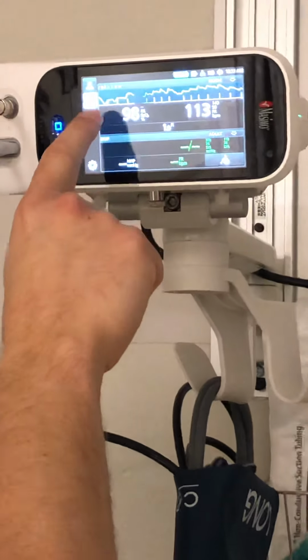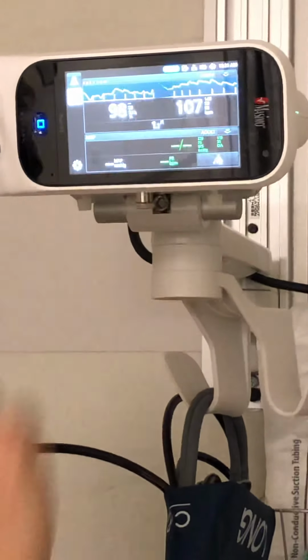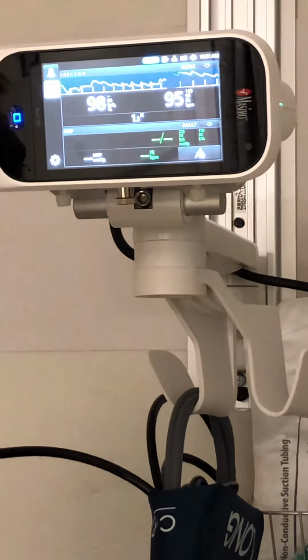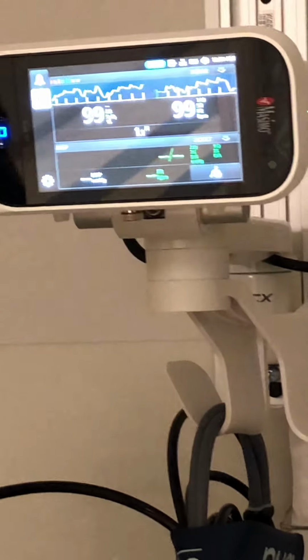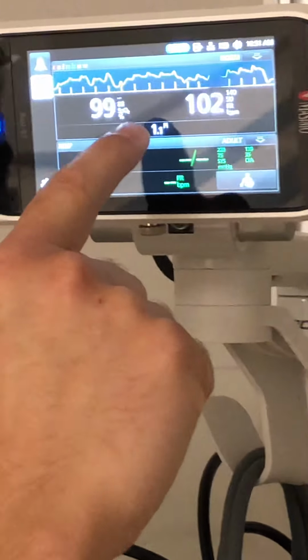But on top of that, if you're looking right beneath the pleth waveform at those little white spikes, each one of those white spikes represents a pulse beat. And if you think about bars on your cell phone, the taller the white spikes, the better signal quality that you have, okay? In addition to that, we have a parameter here that we call PI.